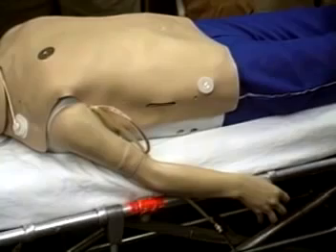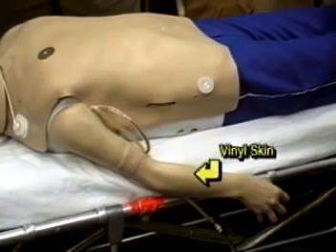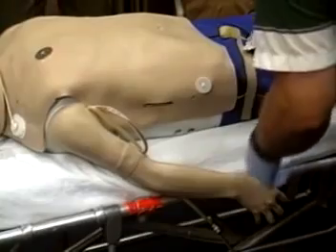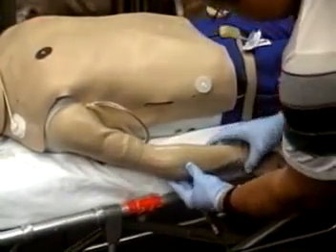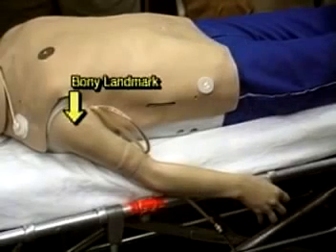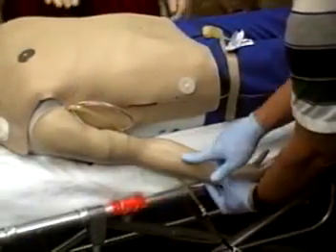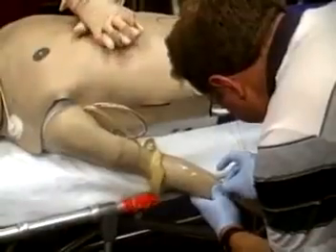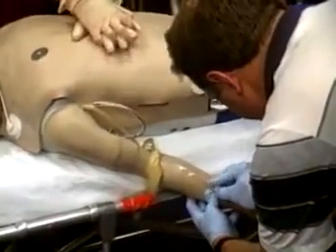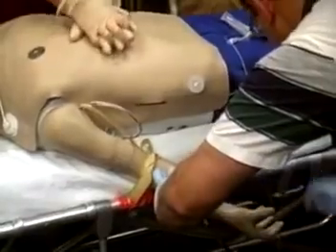The IV arm features realistic vinyl skin and latex veins. The arm pivots at the elbow for easy access to the antecubital fossa, the forearm, and the back of the hand. A bony landmark at the shoulder helps identify muscle tissue for intramuscular injections. The skin actually rolls as you palpate the vein, and the characteristic pop can be felt as the needle penetrates the vein. Realistic flashback occurs with proper insertion.